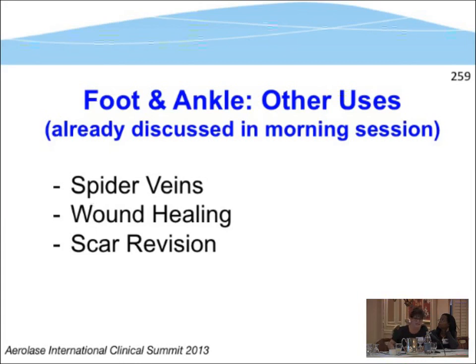So that's that case. This girl went zip lining and got caught in the zip line. She was 17 years old and walked into my office absolutely hysterical, her mother hysterical. I said, okay, I'm going to do laser on her. I believe I charged, because she was ziplining in Costa Rica and paid for it there, so why should I do that for $20? Anyway, she did 5 treatments, really back to back, like every 2-3 days. I met her on the weekend. I held her hand through this, and we got her.